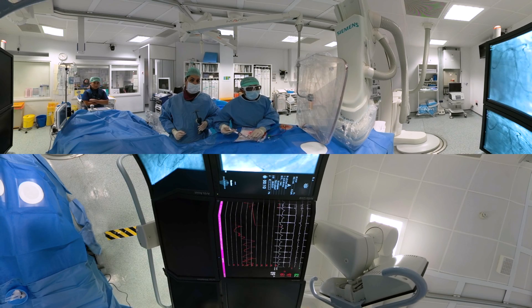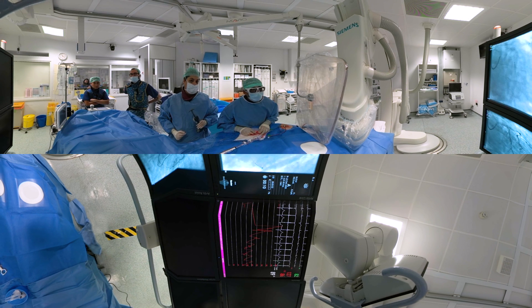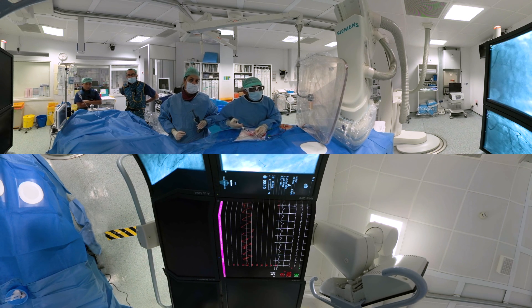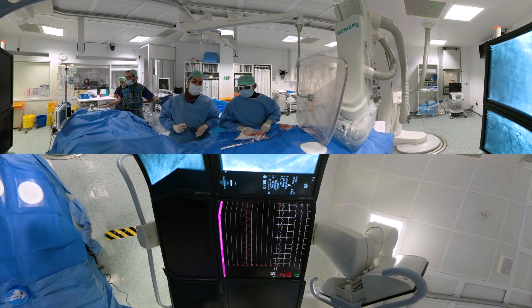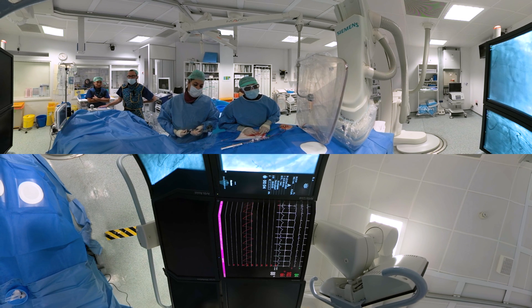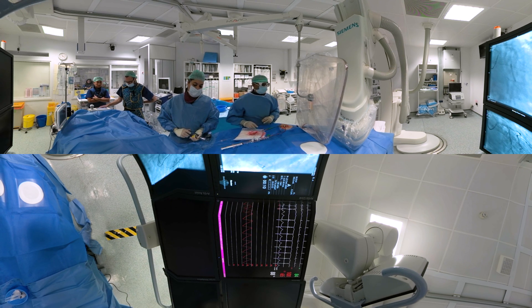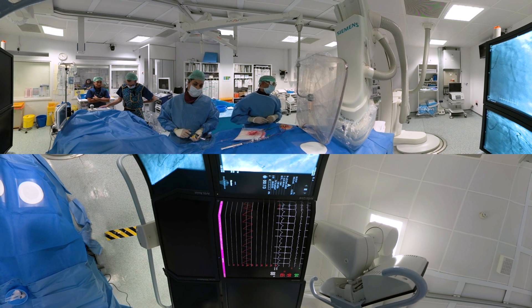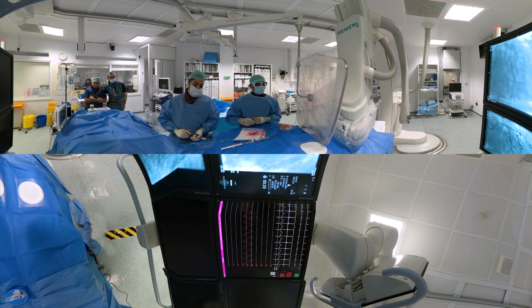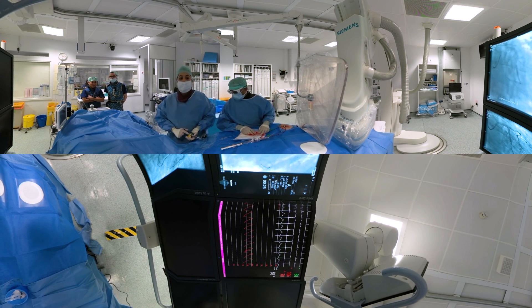We're going to use a stent. The stent has a metal scaffold that keeps the artery open. It goes in at quite high pressure and it stays in permanently. The stent is mounted on a balloon and also goes on the wire. Inflating the stent — going to eight, ten, twelve bar. We're expanding this stent into the artery. It's common to get some discomfort with that, which usually lasts for a short time. We'll leave the stent expanded for a few seconds to allow the metal to expand into the artery.